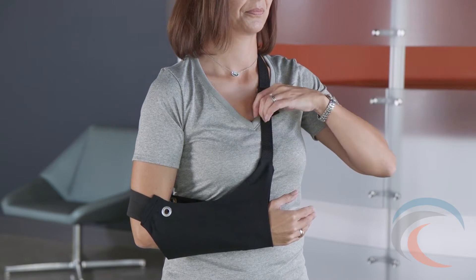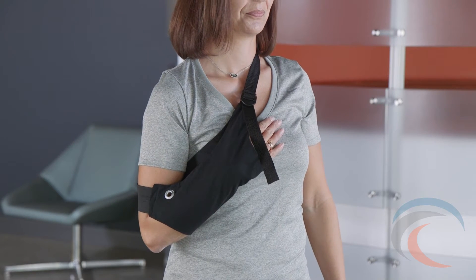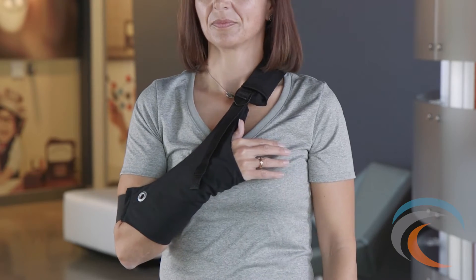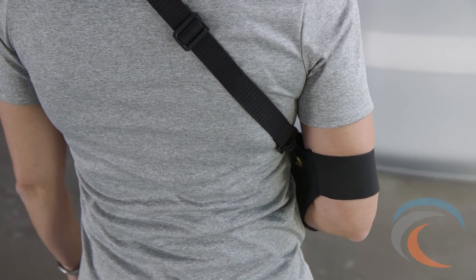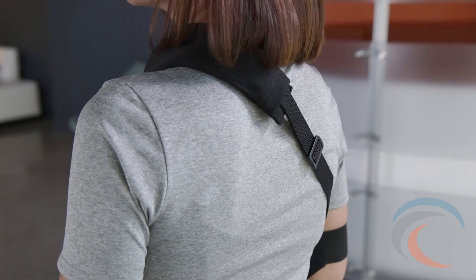Easily elevate the arm by gently pulling down on the pulley strap until the hand is securely positioned above the heart. Notice that the arm is tucked safely against the body to protect against secondary injury. Wingsling includes a padded crossbody strap to eliminate neck strain and overcompensation from the uninjured side of the body.